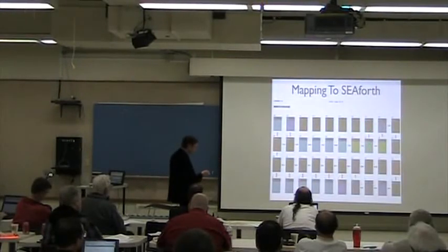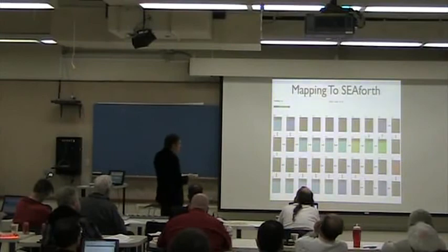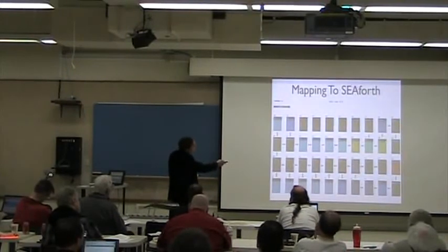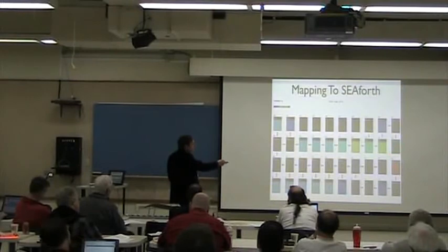And this is the division, and this is where we put the signal, all 8 channels, together. So it's kind of a mixer, and this is just a pipe, because we couldn't connect it this way. And then we kick it out. So we're running the driver of the codec in here.